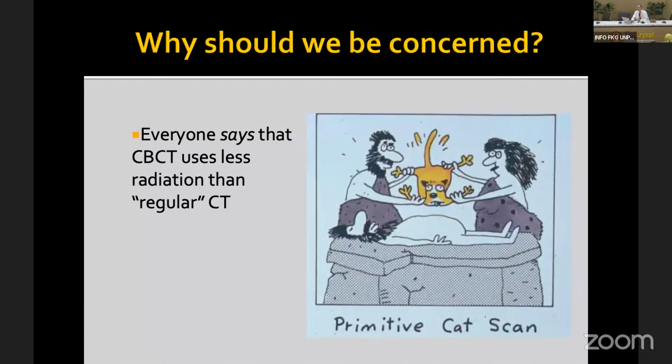Some people argue that CBCT uses less radiation than regular medical CT, which is true. If we're talking about medical CT, the radiation dose is much higher. CBCT, although it's not like medical CT, is still significantly higher when compared to intraoral and extraoral imaging.